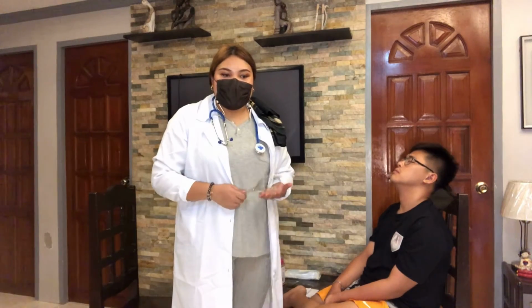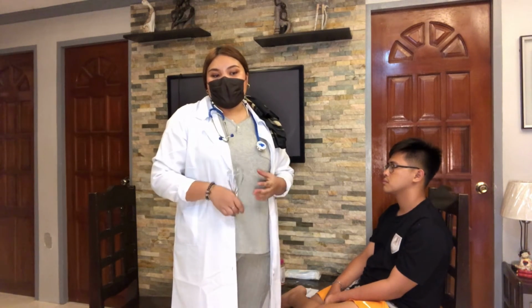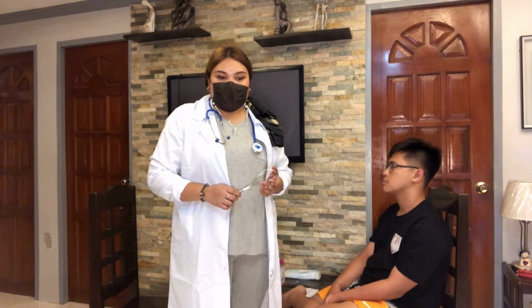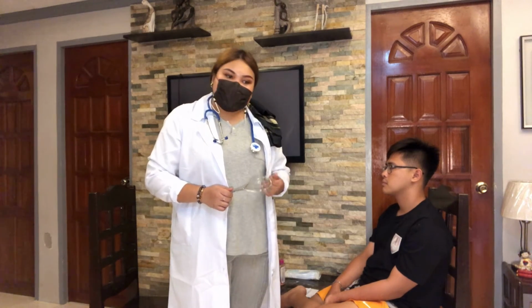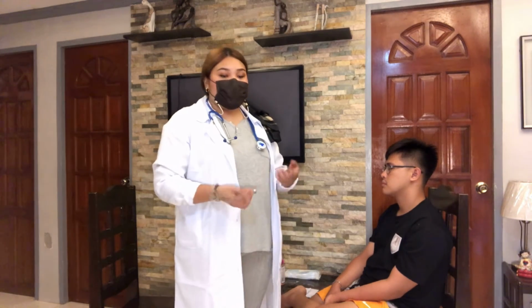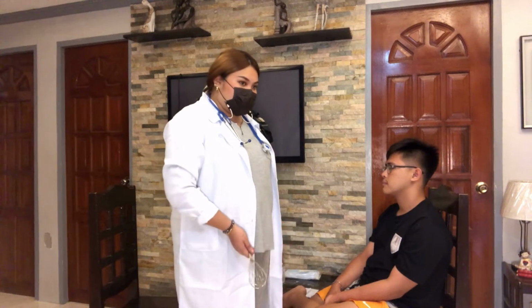As you can see, I'm still performing the Weber's test, and I'm going to activate now the tuning fork to perform the Rinne test. So after activating your tuning fork, place it on the mastoid process in one ear until the client states that the vibration can no longer be heard. And we would also place the vibrating fork in front of the client's ears, so remove any accessories that hinder in the ears of the patient.